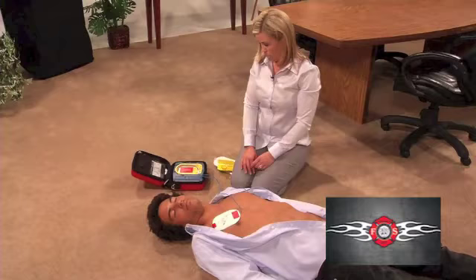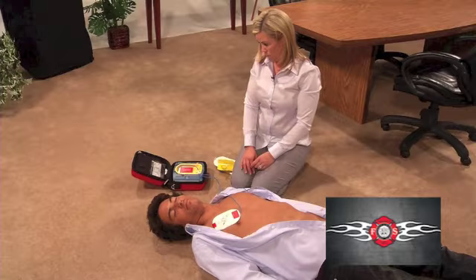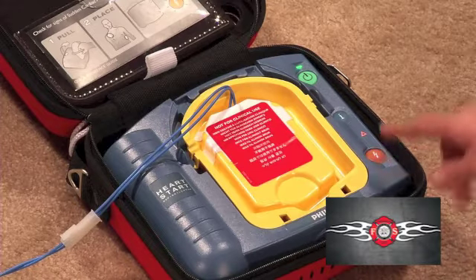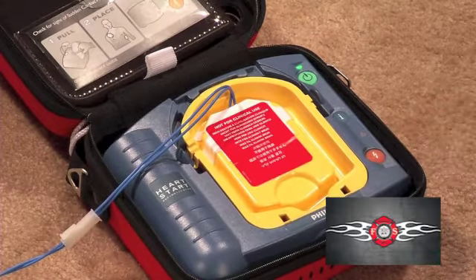Analyzing. Shock advised. Stay clear of patient. Make sure no one is touching the patient. Press the flashing orange button now. Shock delivered.